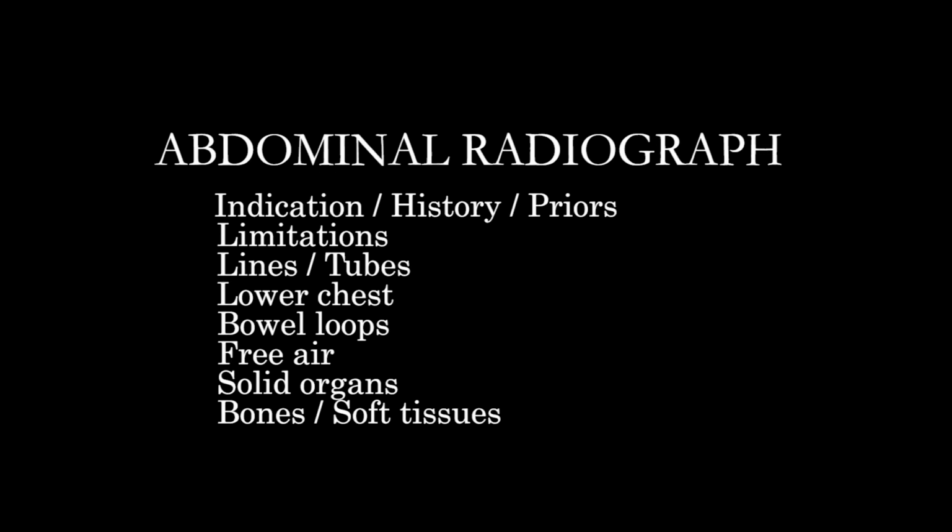There are very few indications left for the abdominal radiograph. A lot of concern for acute pathology will be evaluated by CT. Following known pathology, whether it be infectious, inflammatory, neoplastic, or traumatic etiologies will generally be done by CT.